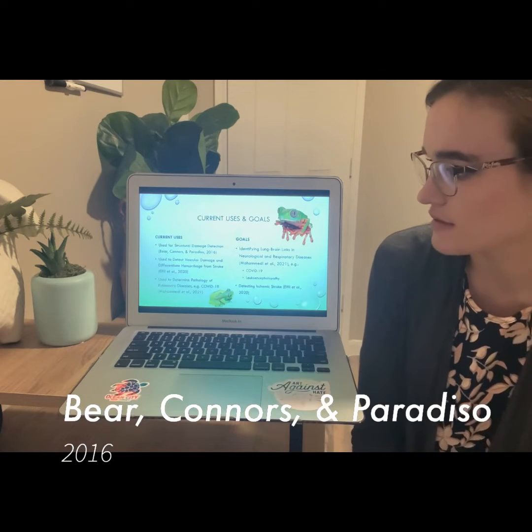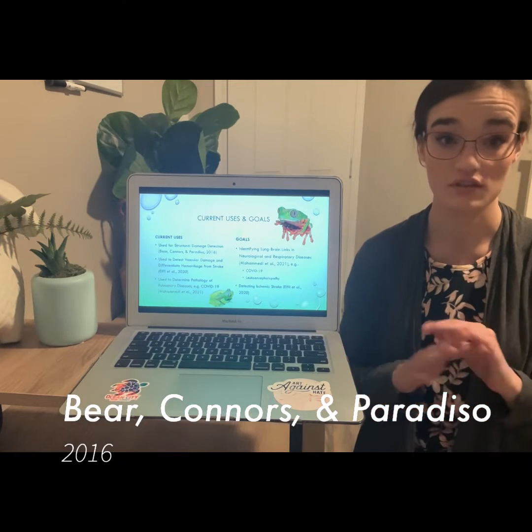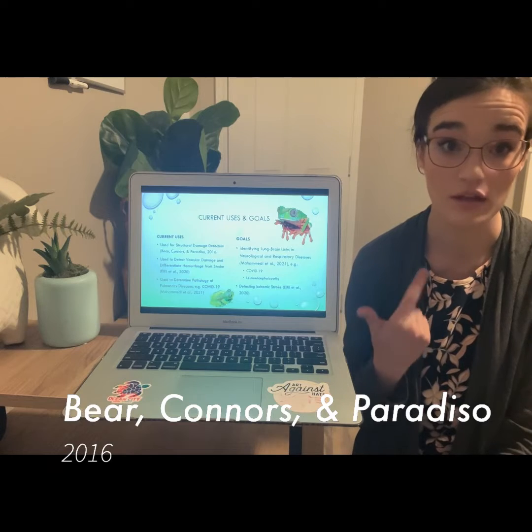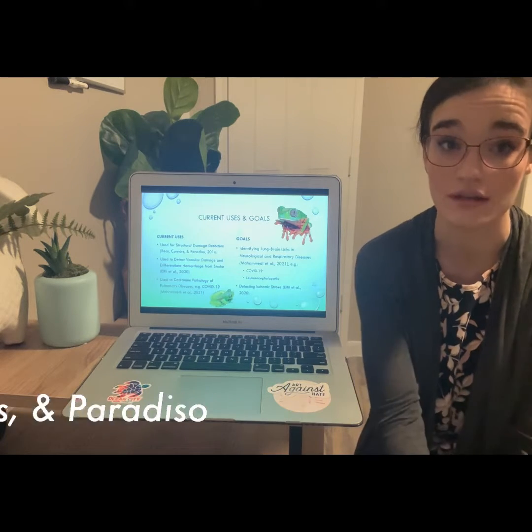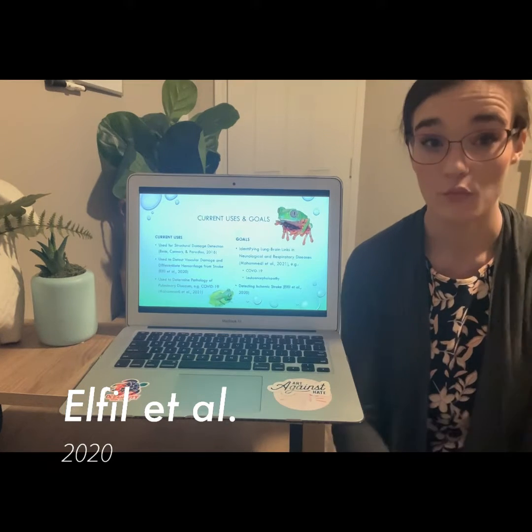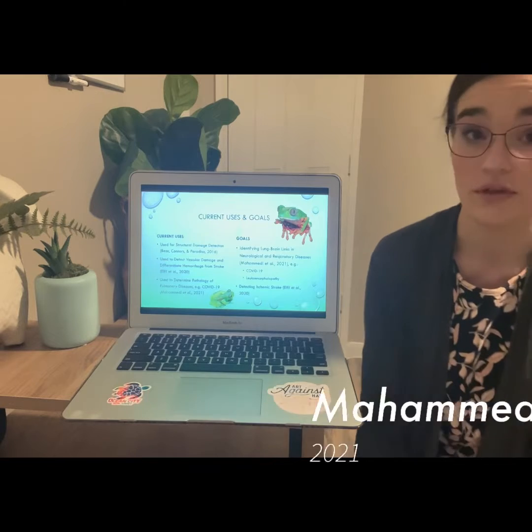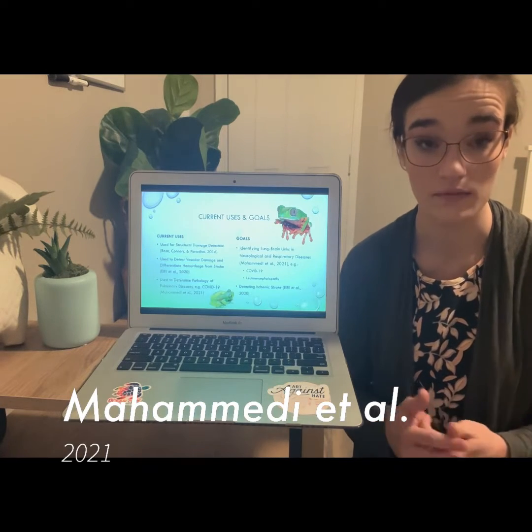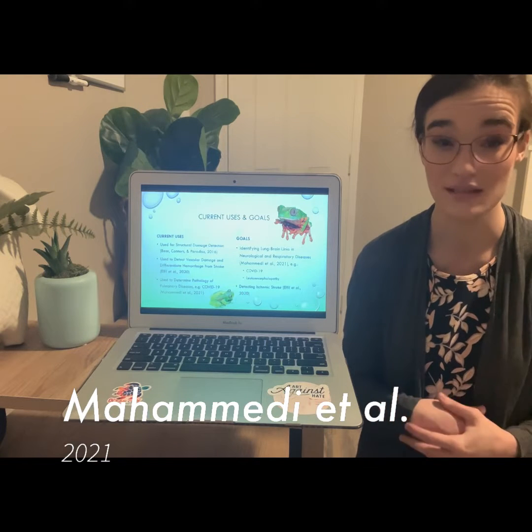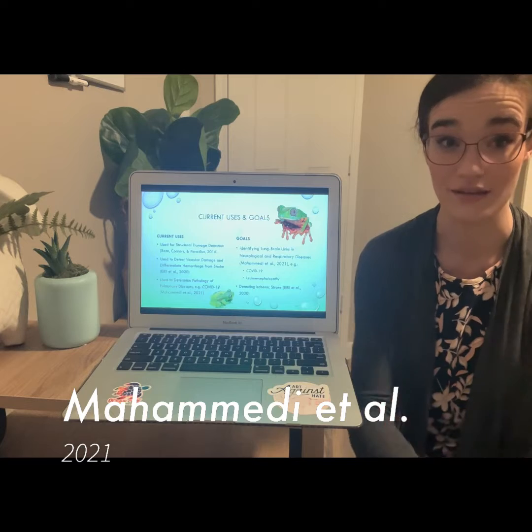So as of right now, CT is used for structural damage detection, just in a very broad sense, referring to vascular damage, tumors, brain injuries. It's also used more specifically to detect hemorrhages versus other types of vascular damage. And it can be used to determine the pathology of other diseases in the body, such as pulmonary disease. Especially recently, it's been used to determine what COVID-19 looks like in the lungs.